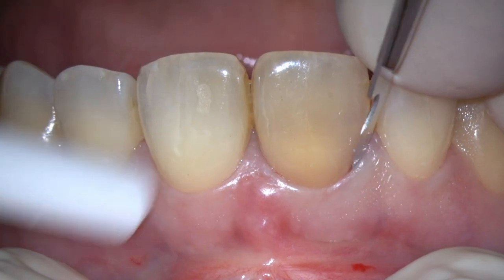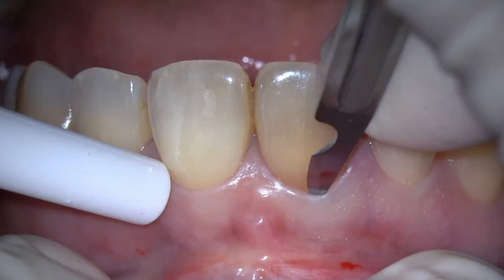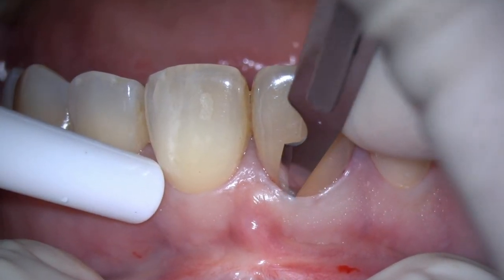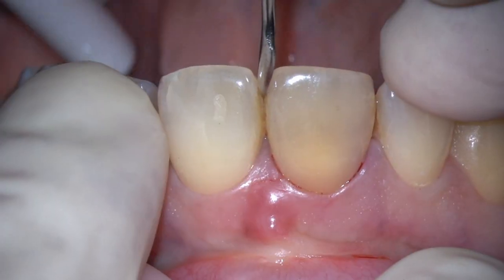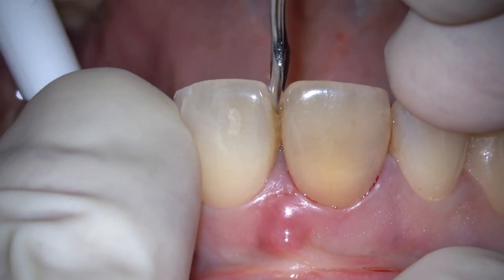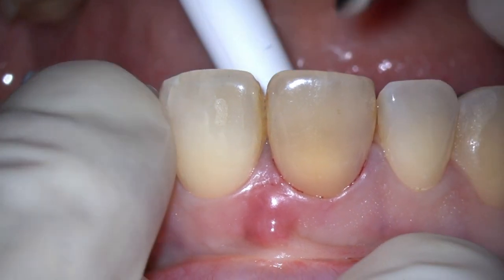Let's start with the extraction of the tooth. I begin with the separation of the supracrestal fibers connecting the keratinized tissue to the tooth, and then we're going to try to luxate with thin instruments.